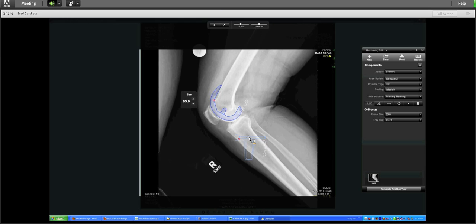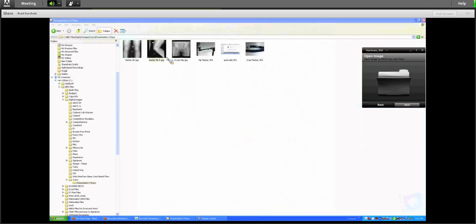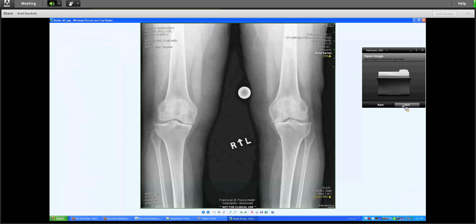Let me look at the tibia now. I'm going to move it back around, kind of get in line with the shaft of the tibia. Get it back out here to the anterior cortex. I'm looking back posteriorly. Let's go ahead and downsize that once and see. I think that's going to be a little small, I'm guessing, so I'm going to go ahead and leave it at this particular view. And now let's go back to that original case that I had and actually template the appropriate size.